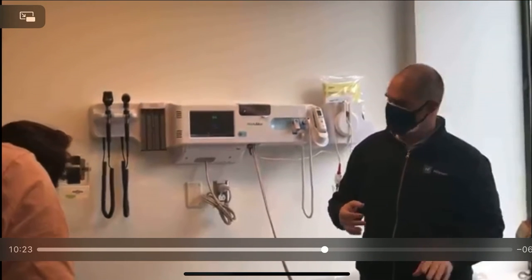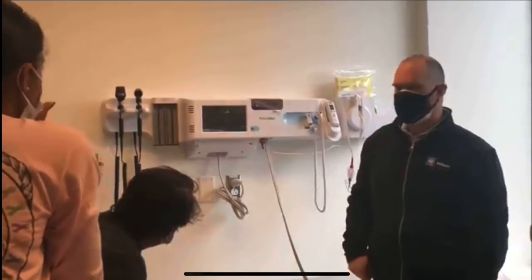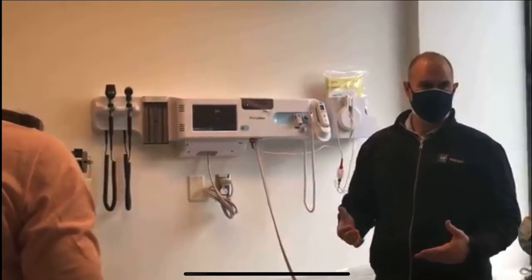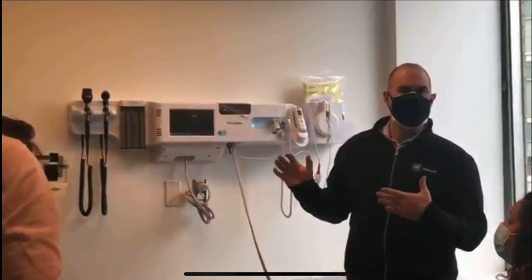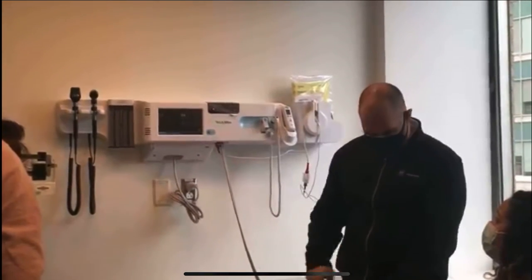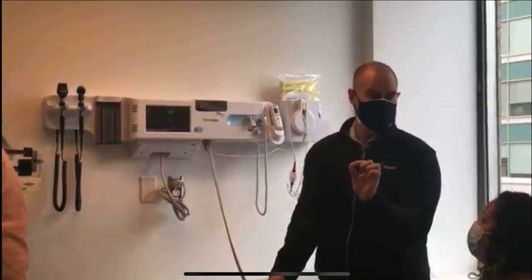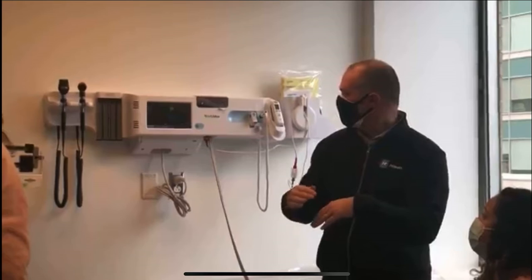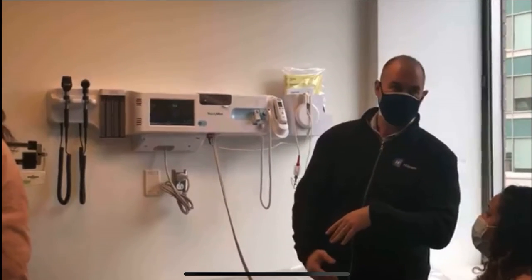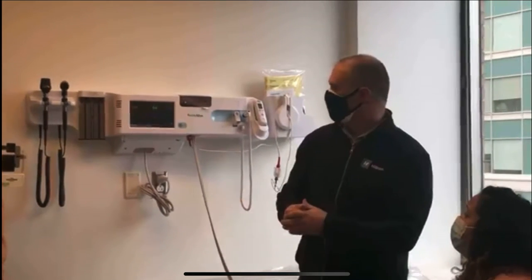What I'm going to do is the first one, which is the STAT. Simply by pressing start, it's going to start the blood pressure measurement. Now this device takes it a little bit differently than you may be familiar with. As the air is going into the cuff right now, closing off on her arm, it's starting to measure her DP. And when it gets up to a certain level, it will drop all the air out and you'll get a nice, smooth, fast blood pressure.